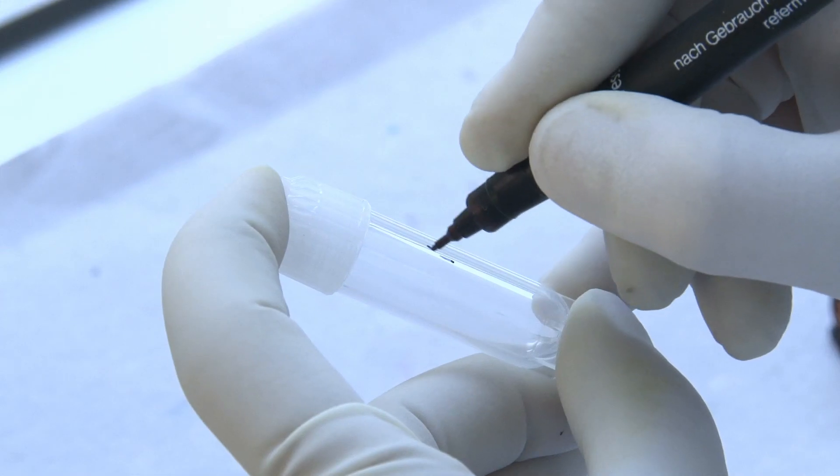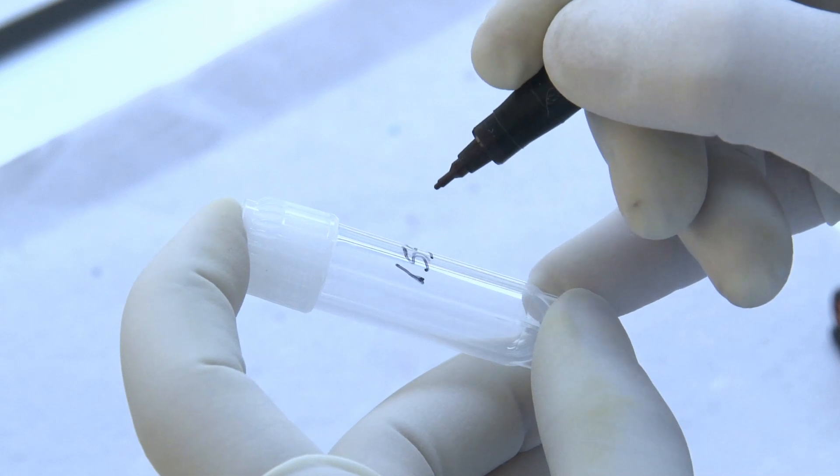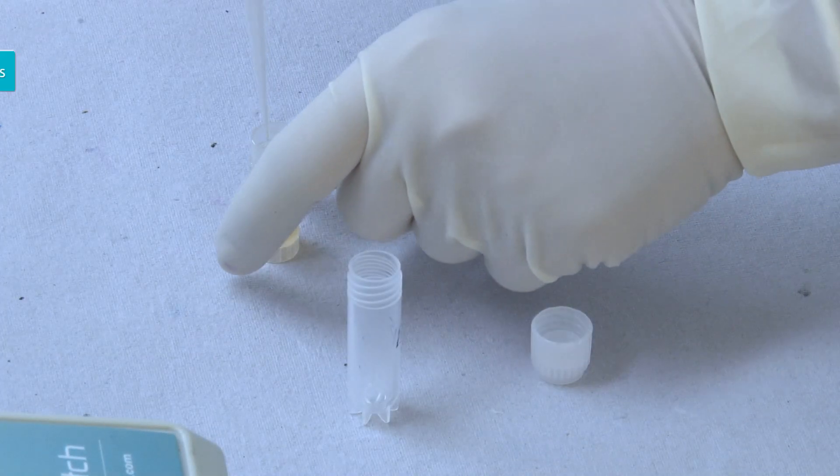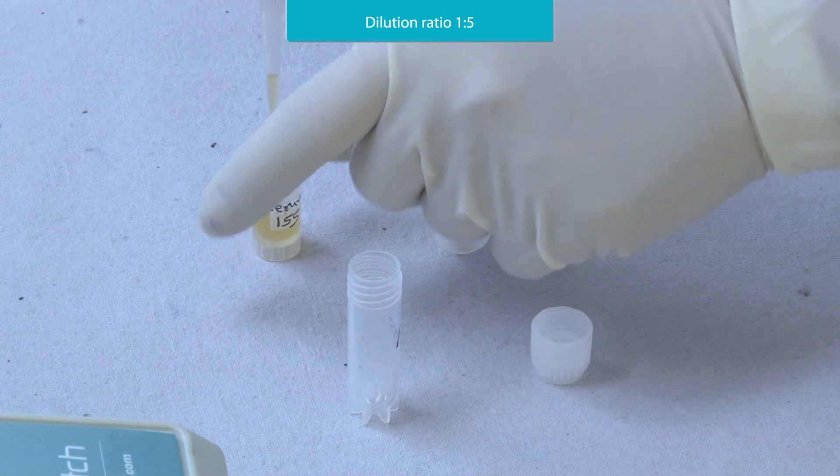Bring all the reagents to room temperature. Take a tube and label it with an ID. Put 50 microliters of serum in the tube and dilute the same.